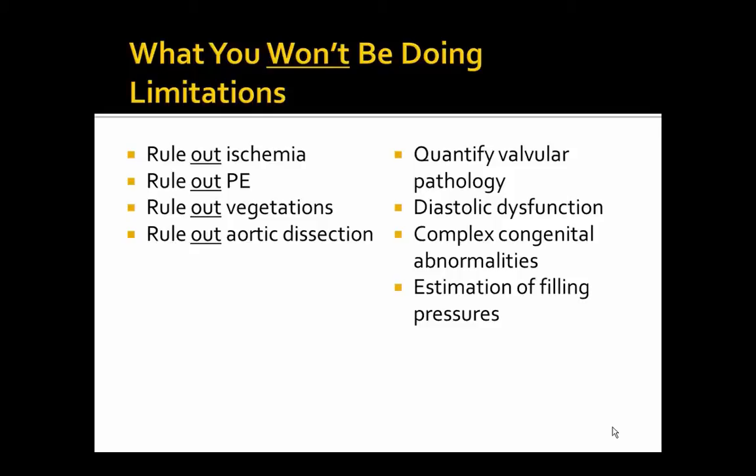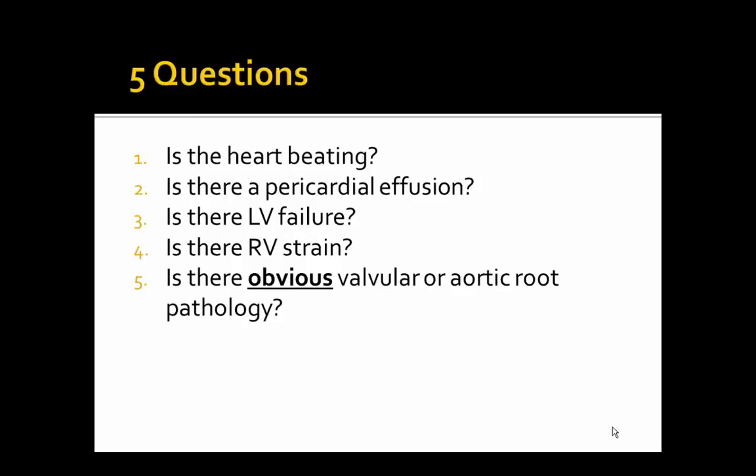You might get some information that makes that diagnosis more likely, but you are not going to rule that out. Important, remember that. So I like to repeat important points. So I think some of the most important points of what we're going to talk about are the 5 questions.